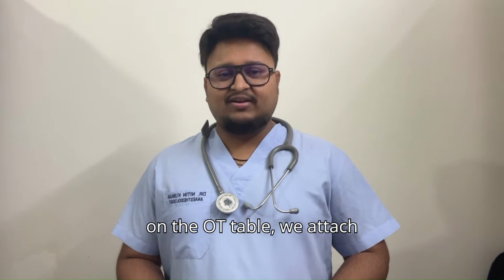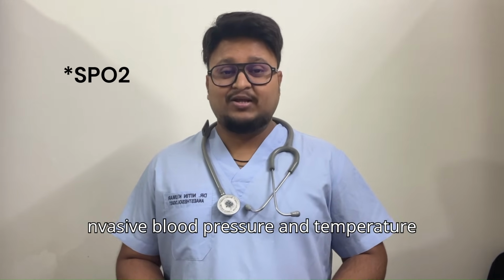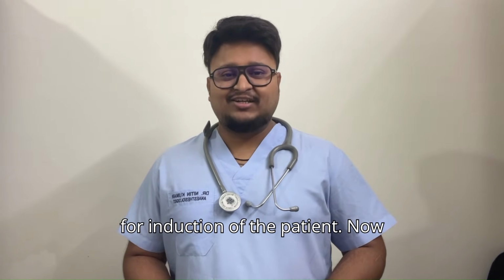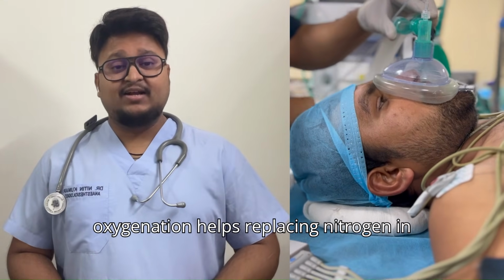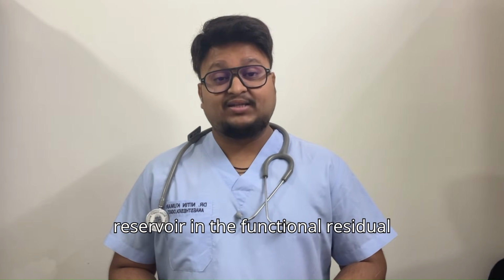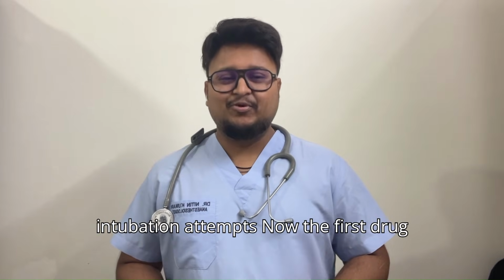Now on the OT table, we attach ASA standard monitors, namely electrocardiogram, capnography, saturation probe, non-invasive blood pressure and temperature, and we secure an IV cannula for induction of the patient. Now our patient is all ready for anesthesia. First, we pre-oxygenate the patient. Pre-oxygenation helps replacing nitrogen in the lungs with oxygen, creating a large reservoir in the functional residual capacity. This increases safe apnea time from 30 seconds to 3 to 8 minutes, delaying desaturation during intubation attempts.